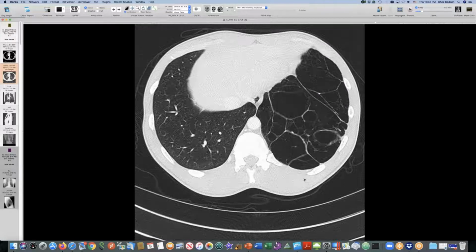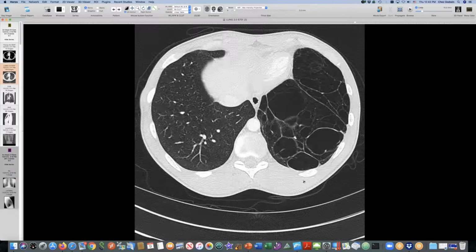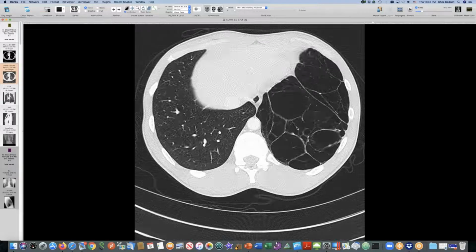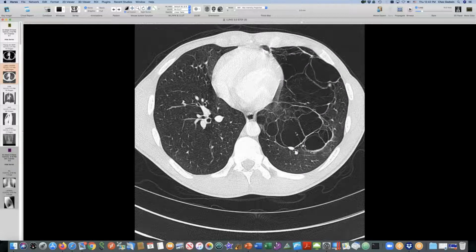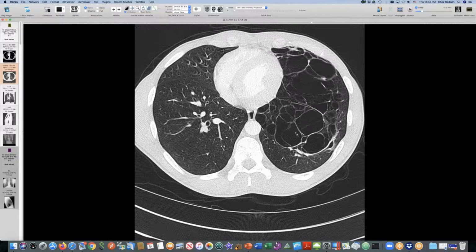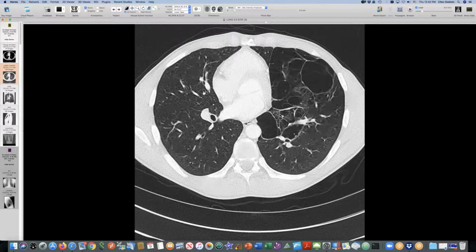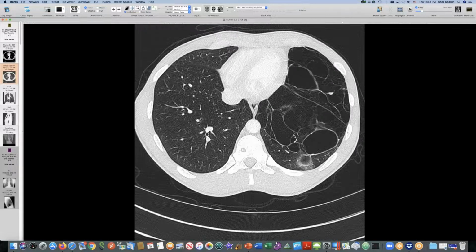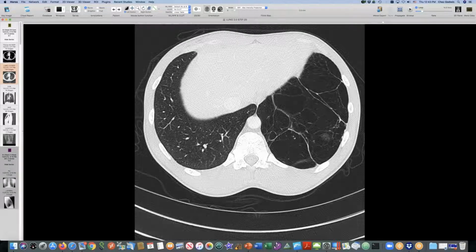And we decided that this was probably a CPAM, a type 1 with the nice big cysts, which does have a certain rate of degeneration into adenocarcinoma, I think. The type 4 is supposed to go to pulmonary blastoma, and type 1 has the complication of some people getting adenocarcinomas of the lung. So very clean cystic abnormality, classic location, left lower lobe.